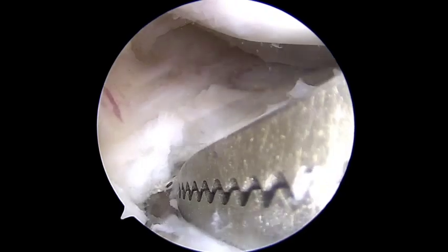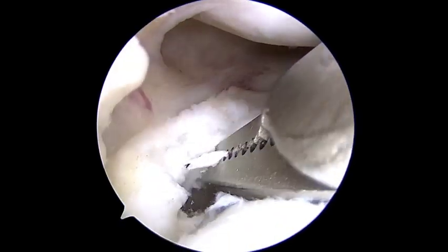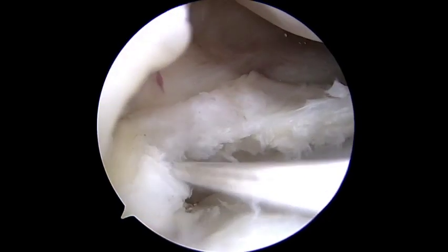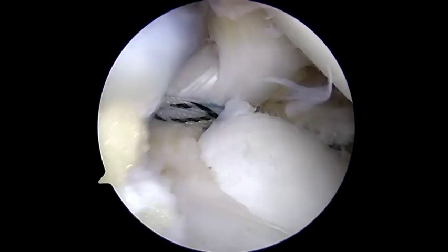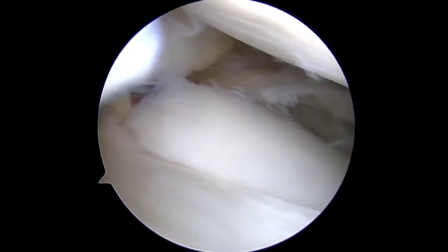Next, a fiber stick suture is passed through the cannulated pin and retrieved through the arthroscopic portal to facilitate passage of the meniscal allograft. Meanwhile, on the back table, a fresh allograft lateral meniscus is sized and prepped for transplantation. A segmental allograft is excised from the cadaver and fiber wire suture is placed through both ends of the meniscus in a vertical mattress fashion.